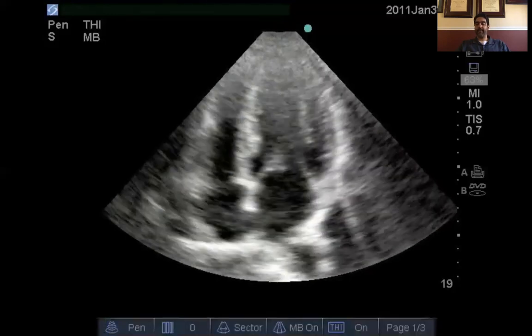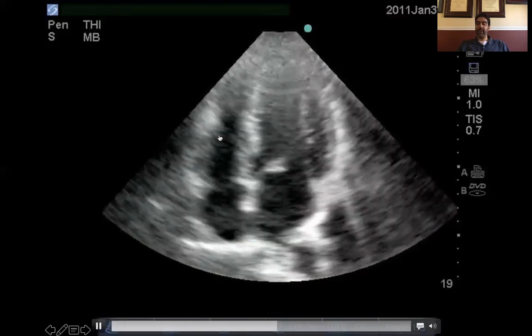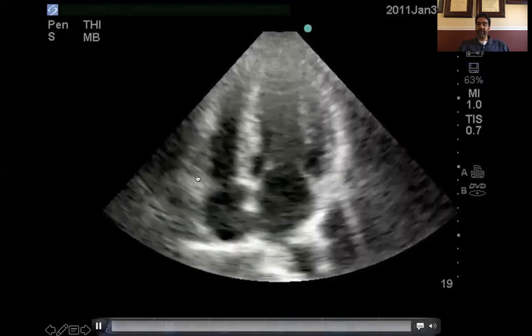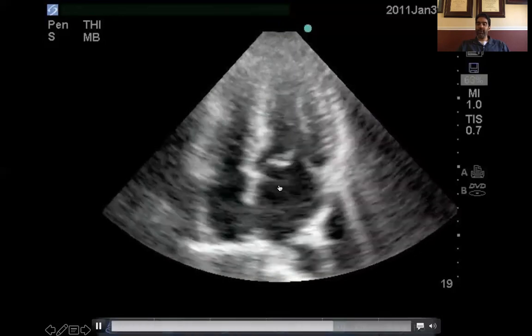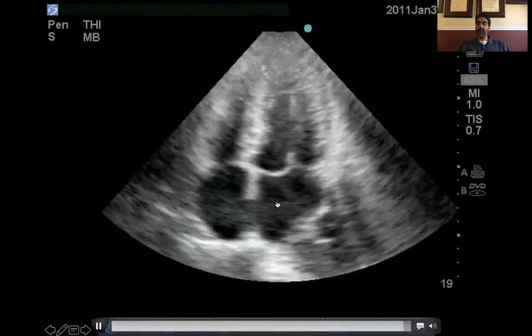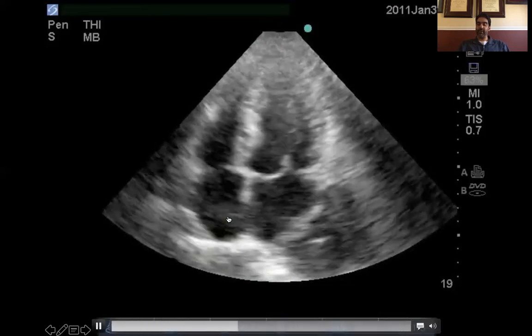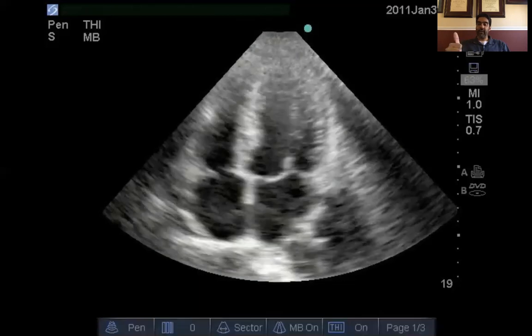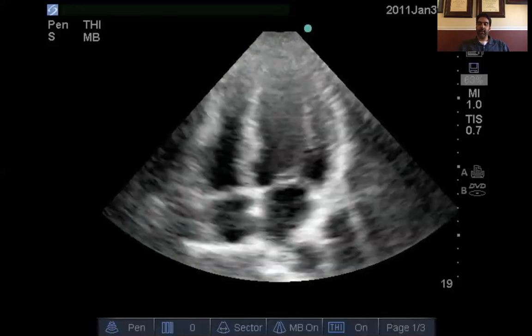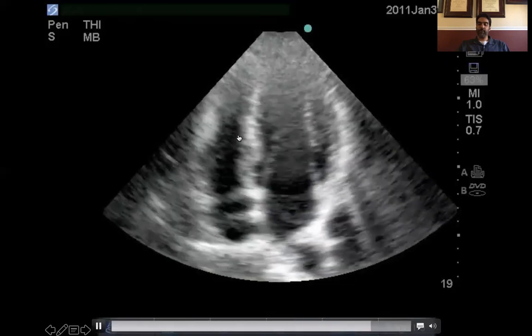This view is good for many things: LV function assessment; it is the only view where you can accurately judge RV size; RV function; color Doppler over the valves to look for severe mitral valve insufficiency; and looking for tricuspid regurgitation when estimating right-sided pressures. You can also sometimes see pericardial effusion here. It is a very useful view — and also difficult to get.